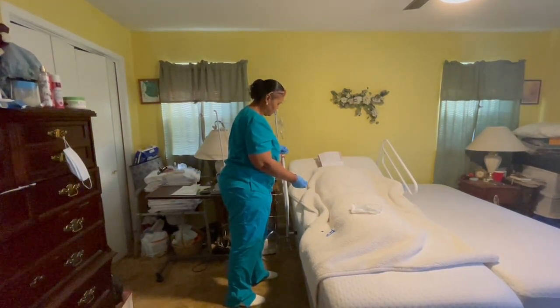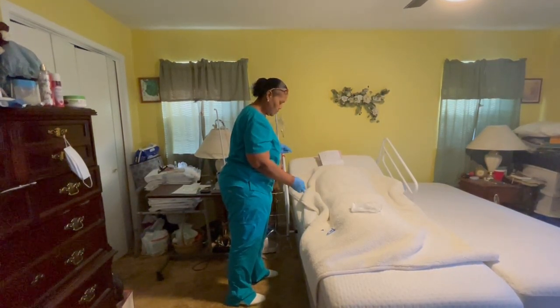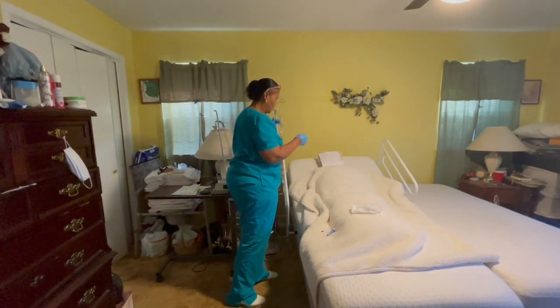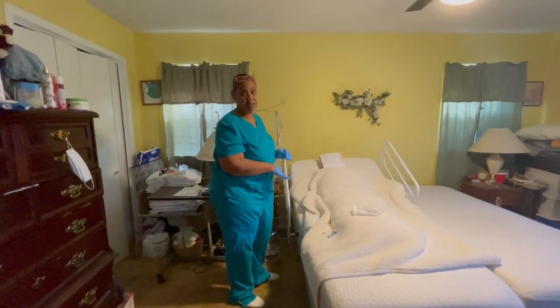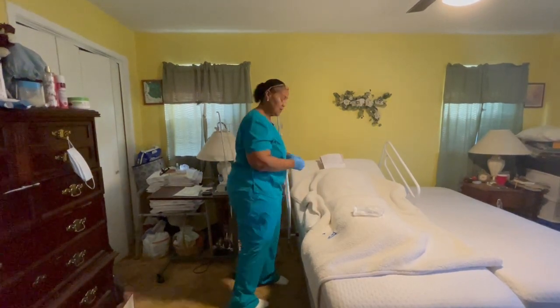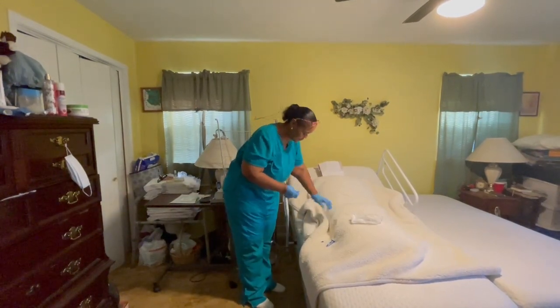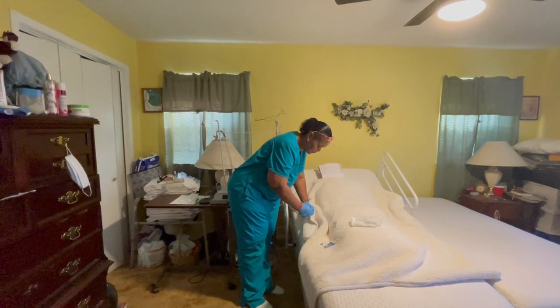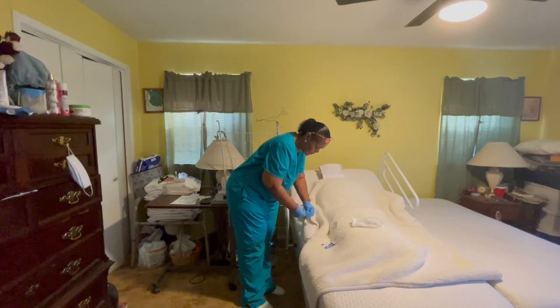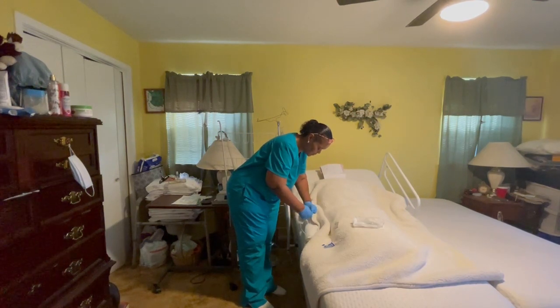Which I have to open that up. Open up my clamp. Sorry, too far. Okay, so once I do that, I apologize, I back up because I need to check my patient's IV. I'm not sure if I said that or not, but I'm going to check and make sure that the IV and everything is okay. Then I'm going to scrub the hub that's closer to the patient. I'm going to take off the tip of my secondary. I'm going to place it on here. Twist it. Make sure it is on there correctly.